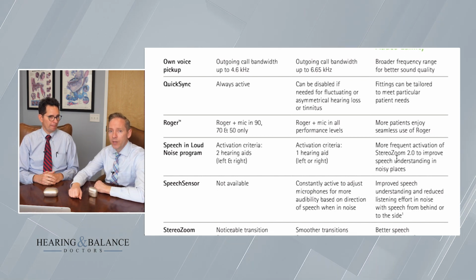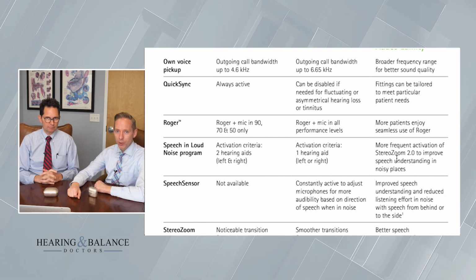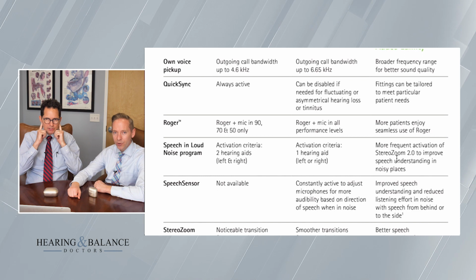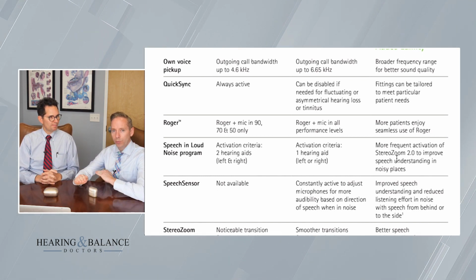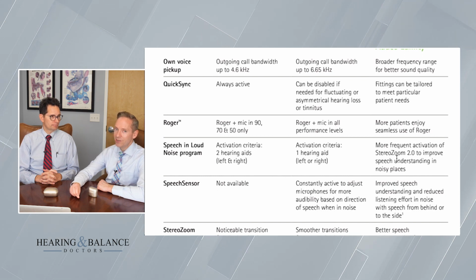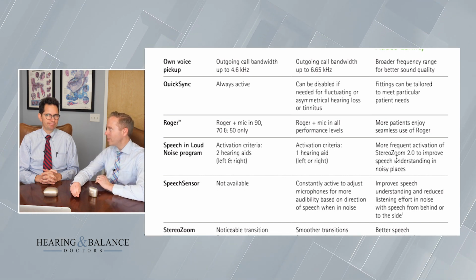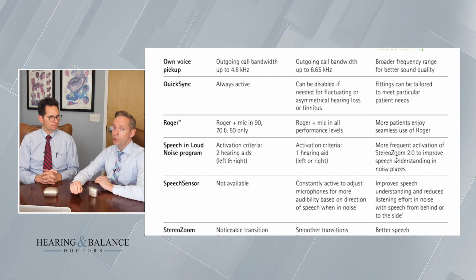And the reason is because Phonak is using traditional Bluetooth. When we hear Bluetooth, we're used to it. We get Bluetooth in our car. You might have Bluetooth speakers. You might have Bluetooth headsets, earbuds, and things. And Phonak uses that traditional Bluetooth that all of those other devices use. The other manufacturers use a low energy Bluetooth, and the low energy Bluetooth just tends to be a little more fickle, especially with Android products. For whatever reason, it drops out a little more, whereas this traditional Bluetooth might drain a little more battery, but it's just more consistent.